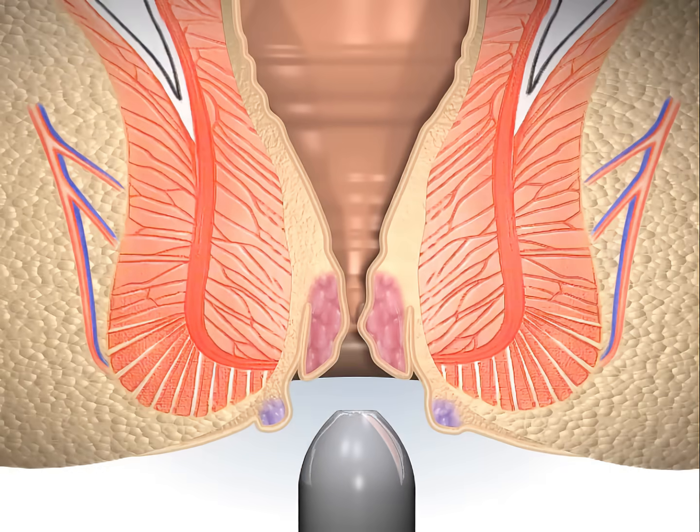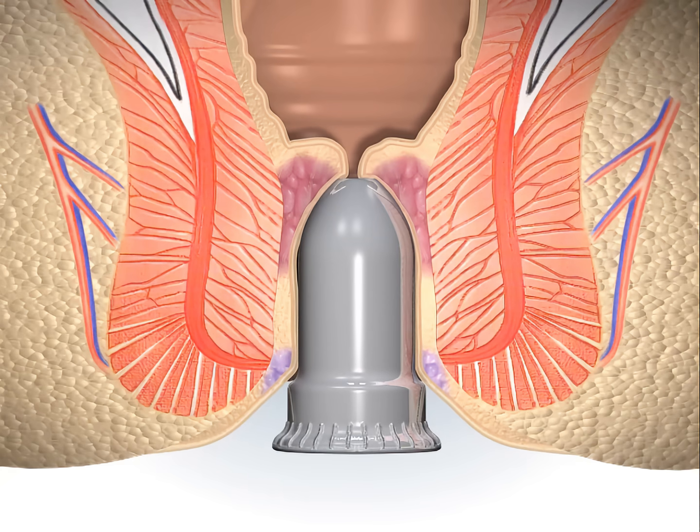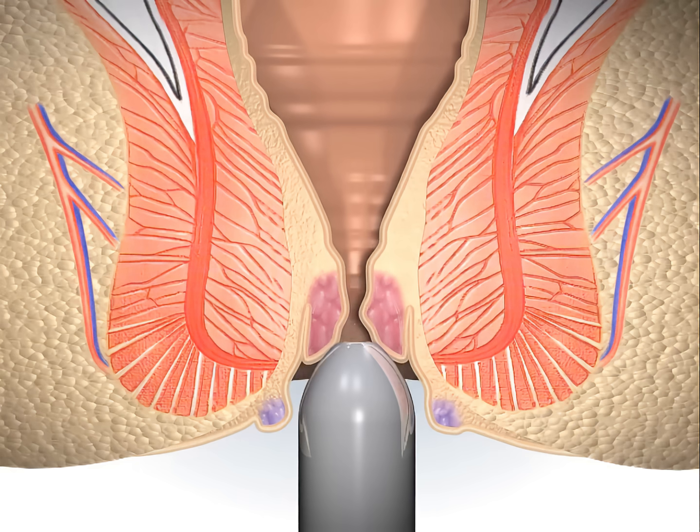The anal verge is gently massaged and dilated before inserting the dilator. It is recommended that the obturator be inserted alone as part of the dilation process.